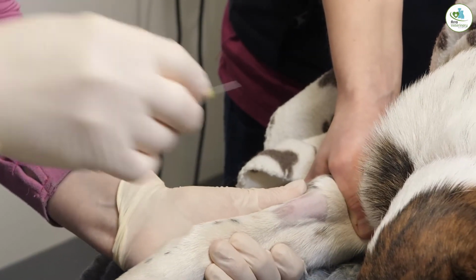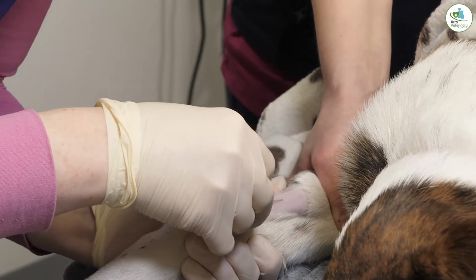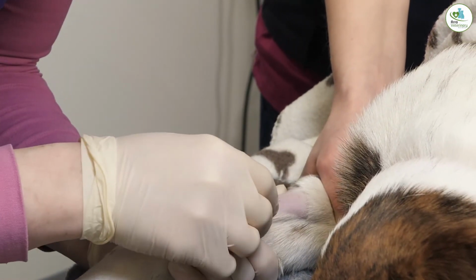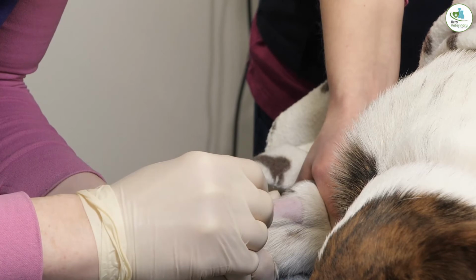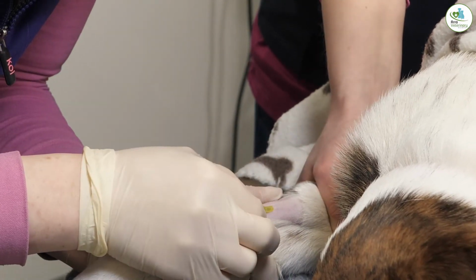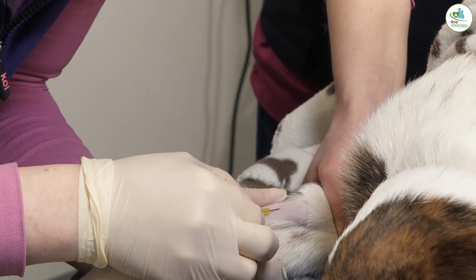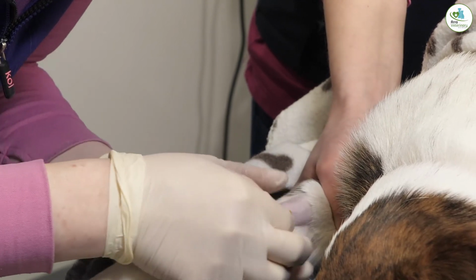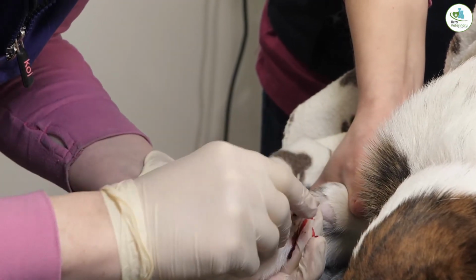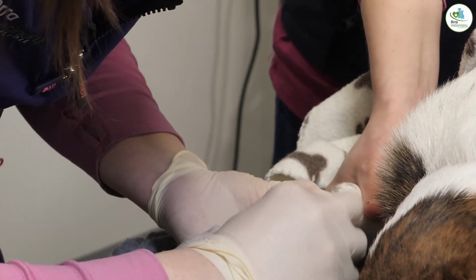So 45-degree angle into the vein. And when you're getting your flash back like that, advance a tiny little bit more and then off the needle. So now that one had to be moved a bit because it was up against the edge of the blood vessel. So just move it around, clean your area.